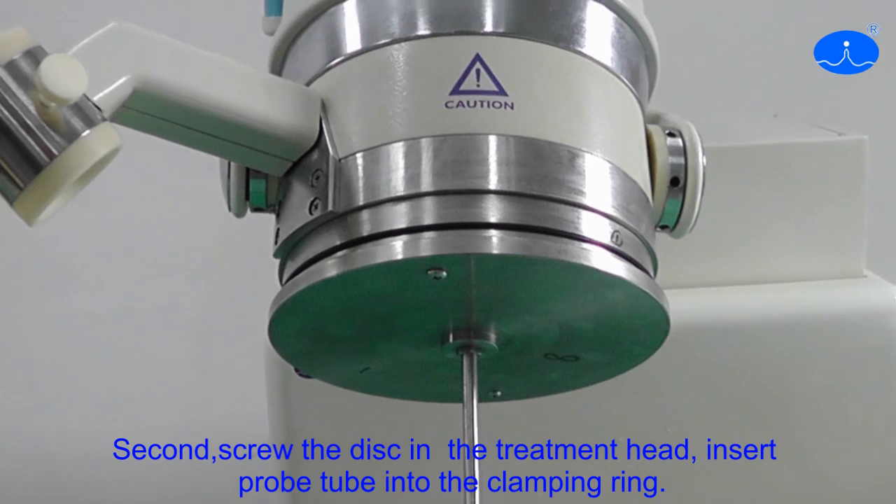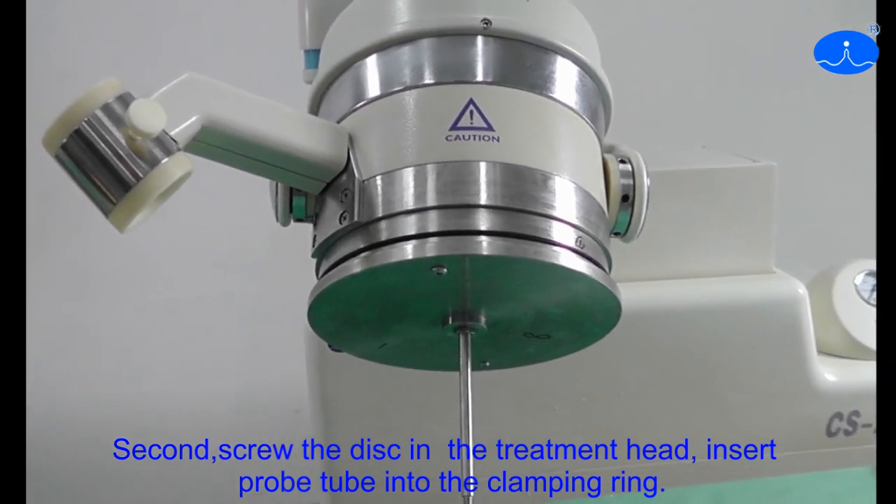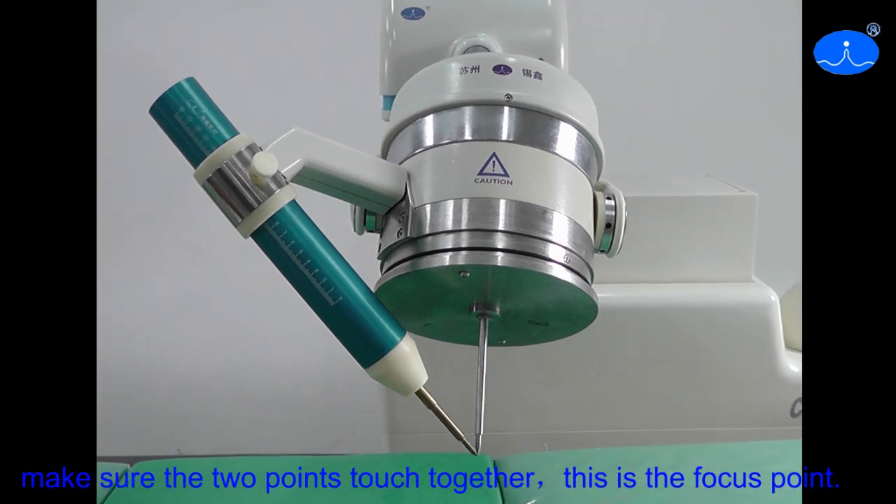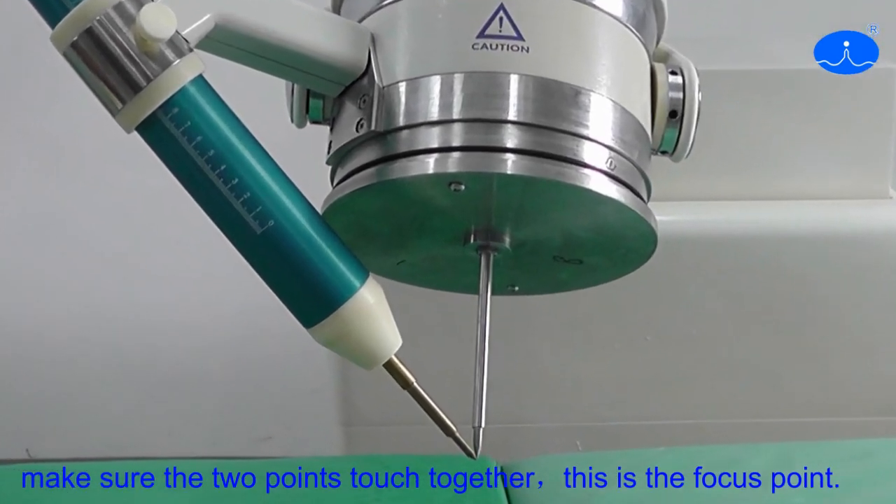Second, screw the disc in the treatment head and insert a probe tube into the clamping ring. Make sure the two points touch together. This is the focus point.